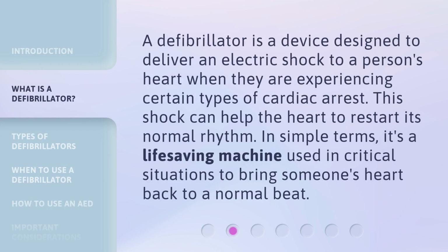A defibrillator is a device designed to deliver an electric shock to a person's heart when they are experiencing certain types of cardiac arrest. This shock can help the heart to restart its normal rhythm. In simple terms, it's a life-saving machine used in critical situations to bring someone's heart back to a normal beat.